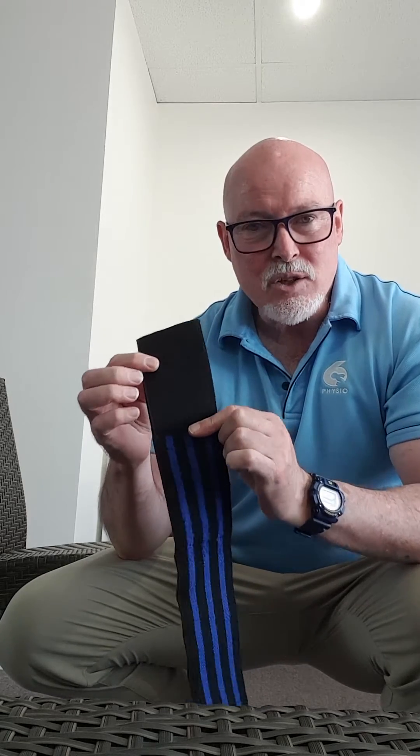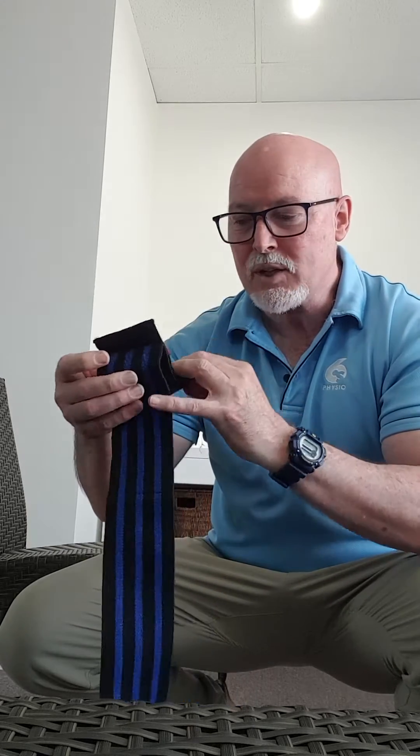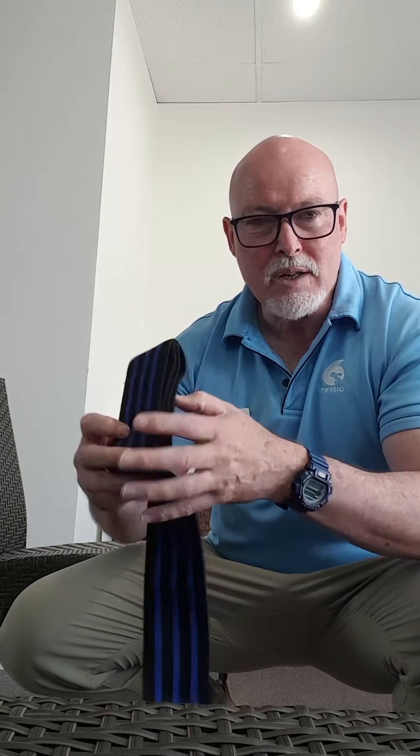First thing is you want this velcro at the end to be on the inside of the roll. The first tip is fold it on itself and then go back in the opposite direction — that way the velcro is always on the right side of the band when you get to the end of the roll.